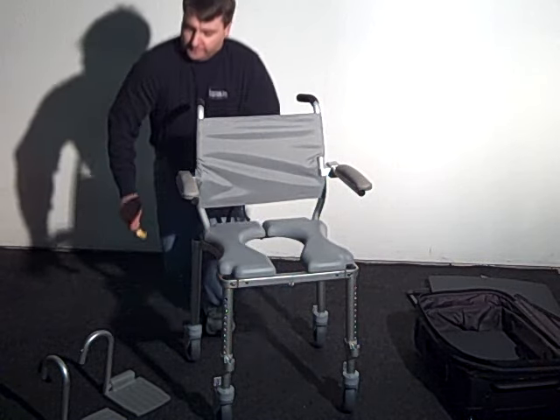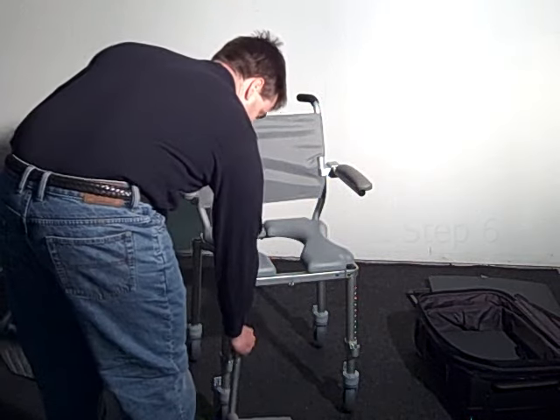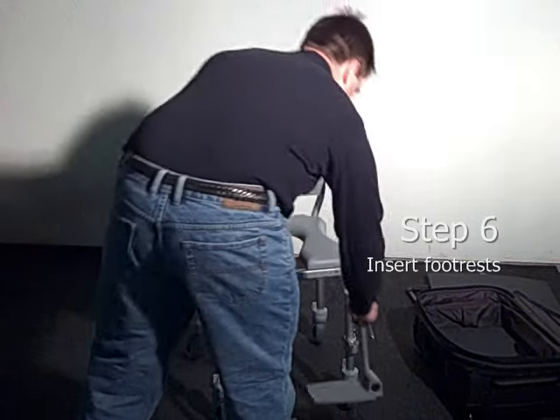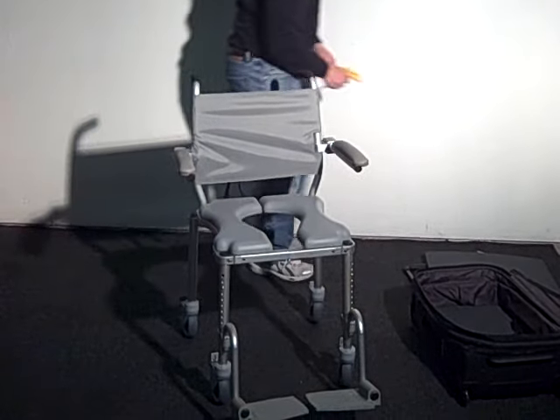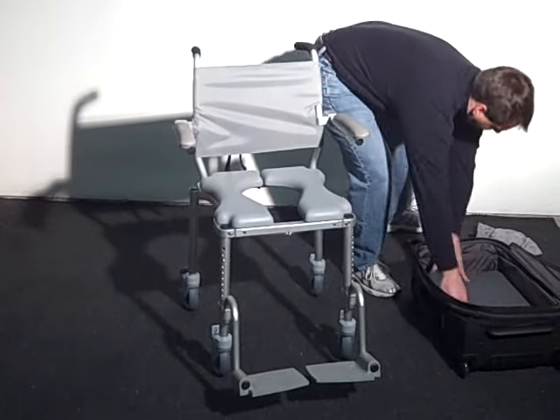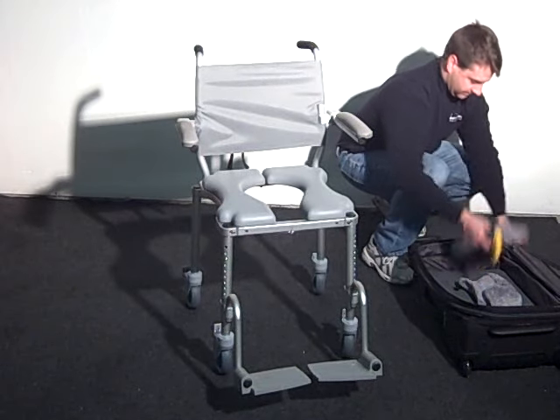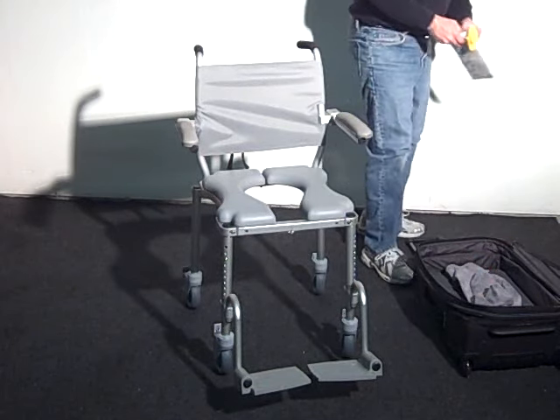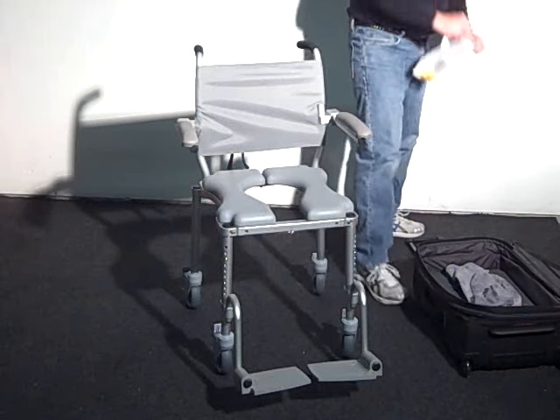The final step is to insert the footrest assemblies. The angle and height can be adjusted if necessary using the T-handle Allen wrench. The MultiChair 4000TX is now assembled and ready for use. The packing items and the T-handle Allen wrench with the instructions should be stowed in the carrying case for safekeeping and future use.